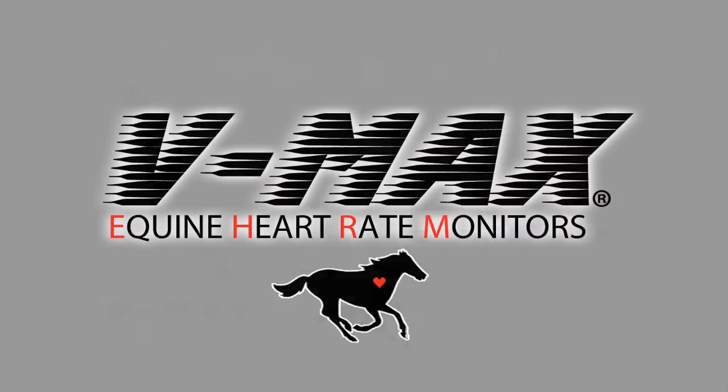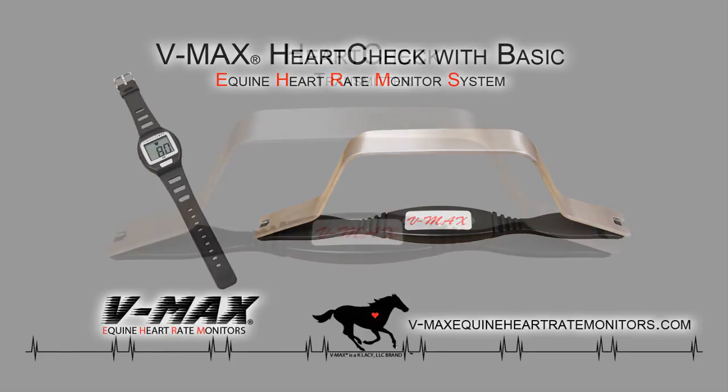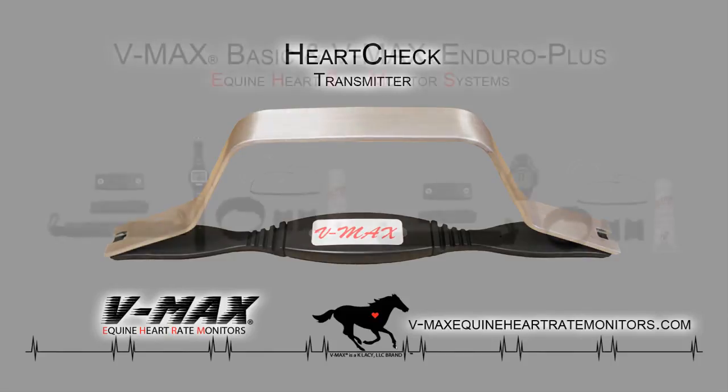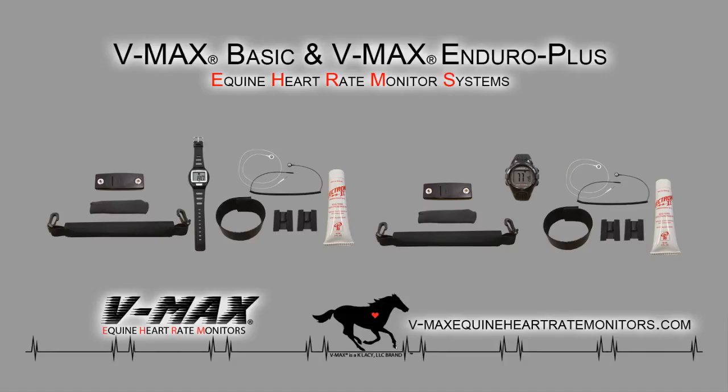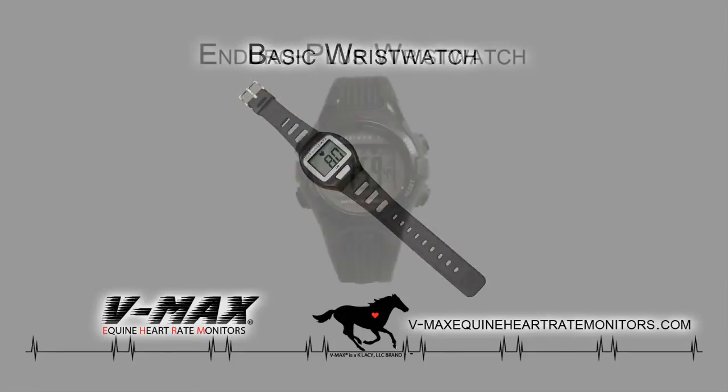Now we come to our VMAX HeartCheck BASIC system. This system allows you to quickly see your horse's heart rate in the vet check area, in and around the barn, or to simply check the heart rate after you have been out for a ride. The system includes the heart check transmitter, which consists of a strong and sturdy handheld aluminum handle with a wireless transmitter attached. Do you already have a BASIC or Enduro Plus EHRMS but want to add the heart check or heart belt to it? No problem — the heart check or heart belt can be purchased separately and will work with your existing BASIC or Enduro Plus wristwatch.